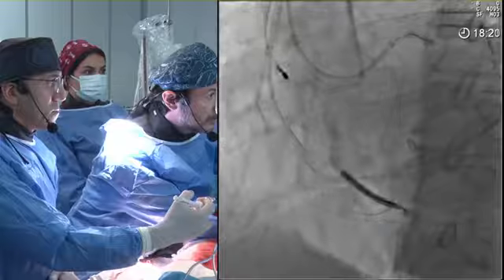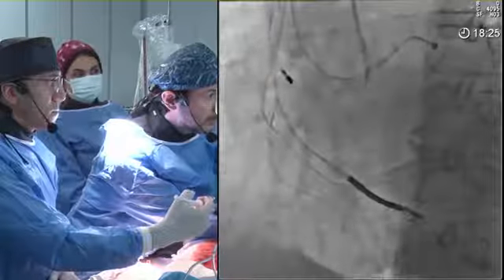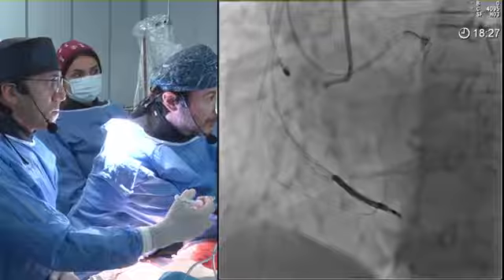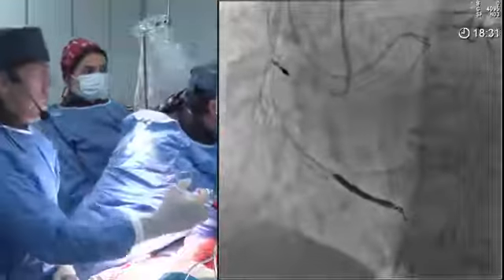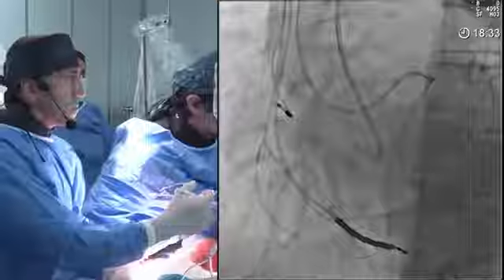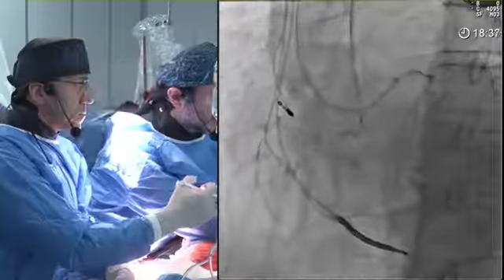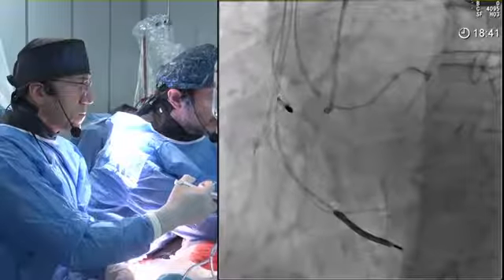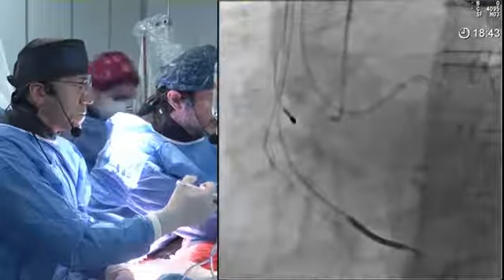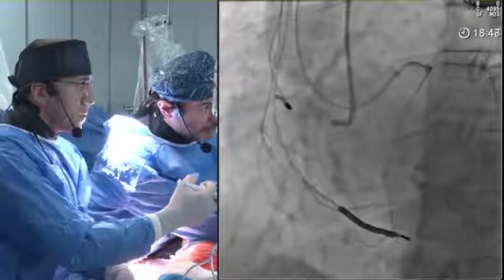So if you've gone through a septal approach, I believe you can get balloons retrogradely. If you get a balloon to the RCA ostium and inflate it, you have a target to puncture antegradely with a penetrative wire, resolving the ambiguity of the right coronary ostium and hence completing the procedure. In those situations, you probably want to use balloons with longer shafts, like the Abbott balloons. They go up to 148 centimeters. So that's something we mustn't overlook, the use of CART.